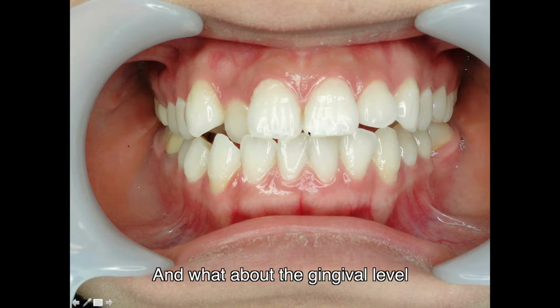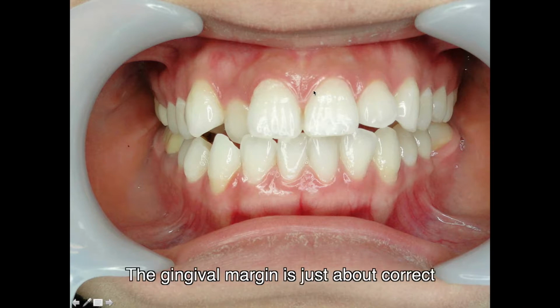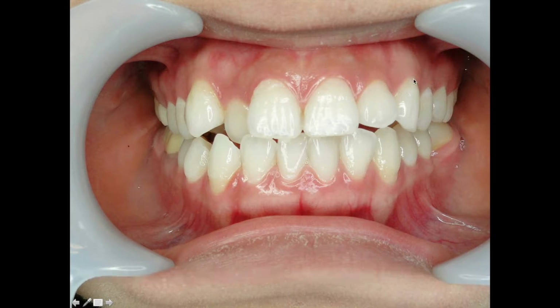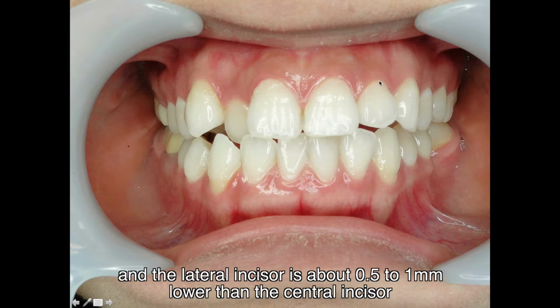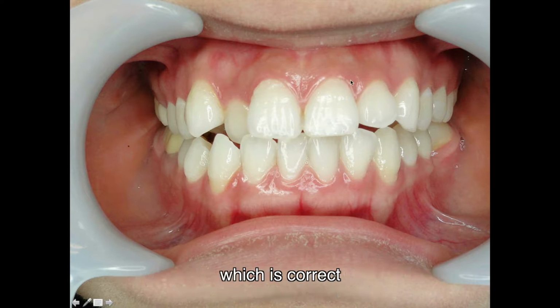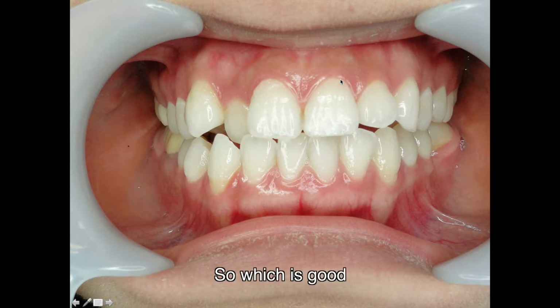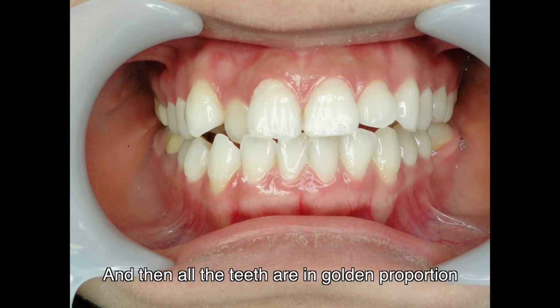And what about the gingival level? The gingival margin is just about correct, because that is almost the same level as the canine, and the lateral incisor is about half to 1 millimeter lower than the central incisor, which is correct. And then also the zenith of the central incisor is a little bit distal to the axis of the upper central incisor, which is good. And then all the teeth are in golden proportion.